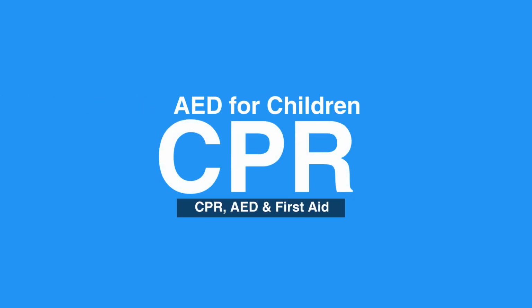Video 6E, AED for Children. Welcome to the lesson on AED for children. In this video, we will discuss AED use in children and go over step-by-step directions to use it.